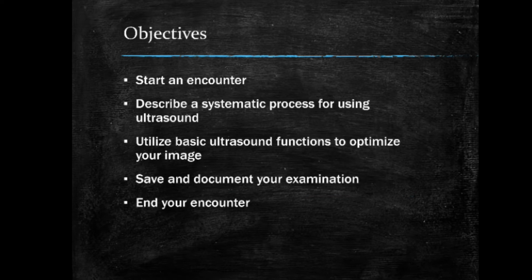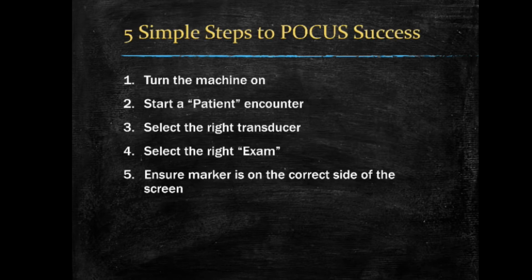So my objectives today are to teach you how to start an encounter, describe the systematic process for using the ultrasound. I advocate using the same way every single time you touch it to make sure you're not missing steps. Utilize basic ultrasound functions to optimize our images, and then save and document our examination, and then end that exam so we make sure we get credit. My hope is that if you do these things, you'll be able to save your time and get better images to help in your clinical care of patients.